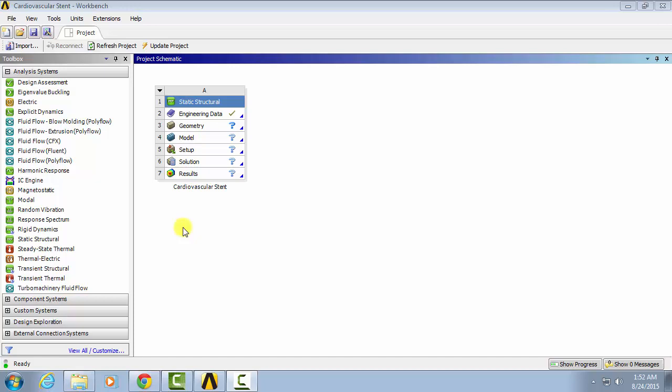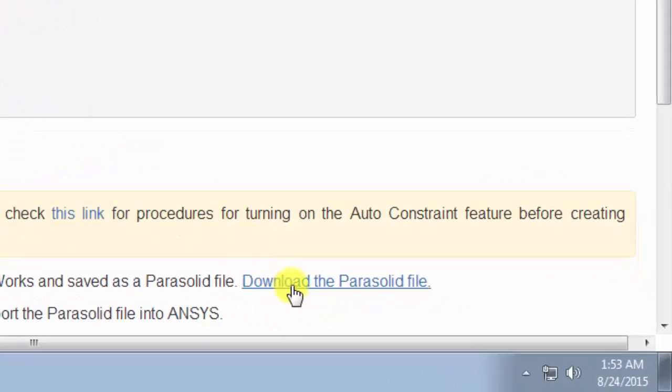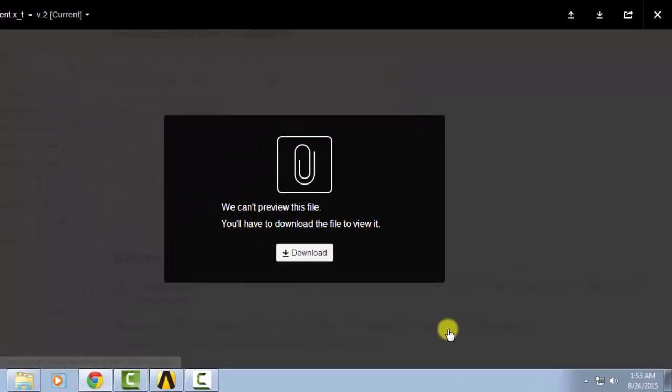Now that we've set the material properties for the stent and the balloon, we'll actually go through and import the geometry and do some final edits. So to do that, we'll download the geometry from the Cardiovascular Stent module under Geometry and just click the Download the Parasolid file.